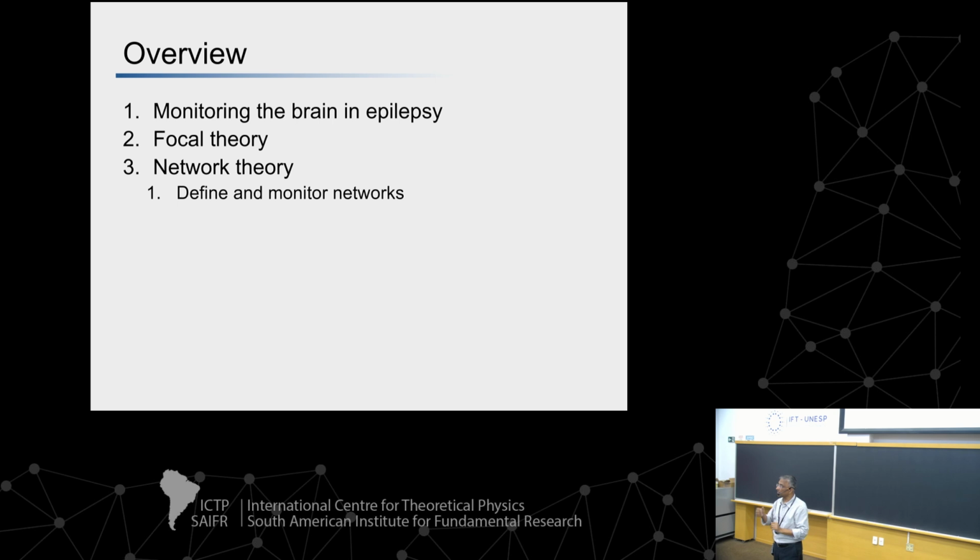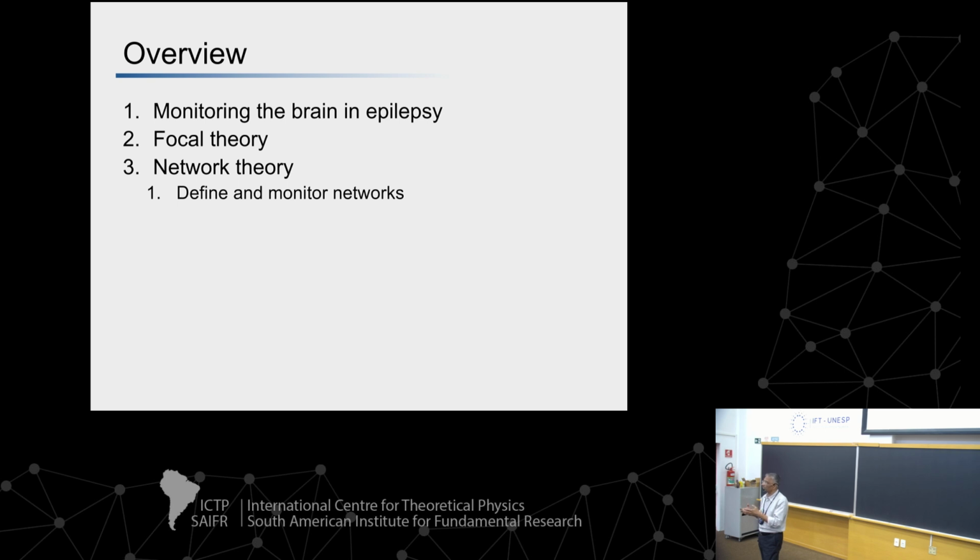It's extremely nice to be able to go down to the single unit level. That is truly a level at which we can build a lot of intuition and understanding, if you understand which class of neurons they are, how they're firing, and what else is firing in conjunction with it. That's why those high channel count systems I mentioned are going up to 1,000 channels, so that you can put in those electrodes in conjunction with our clinical electrodes. You have both low impedance and high impedance amplifiers, so you can collect both kinds of information. You can sample at 4 kilohertz and 30 kilohertz and things of that nature. So this will take time.